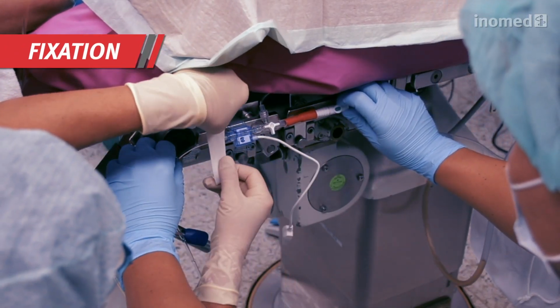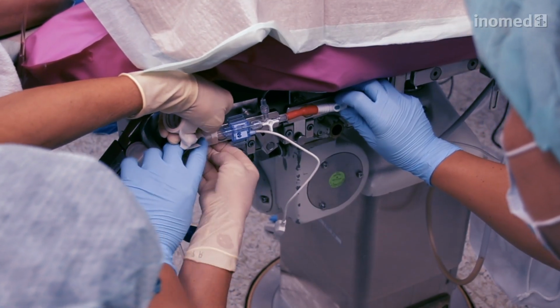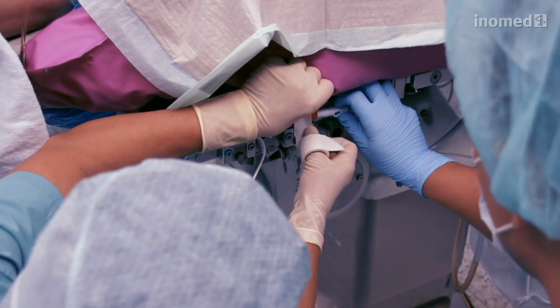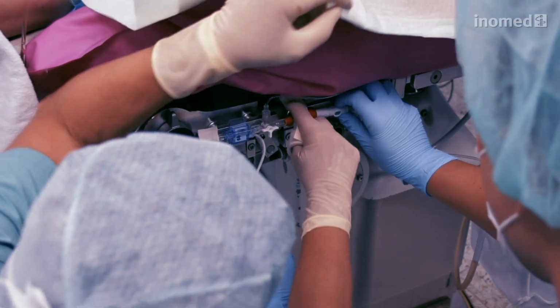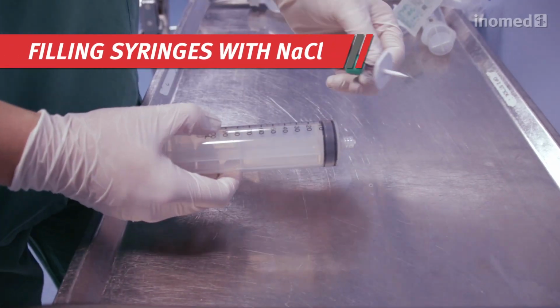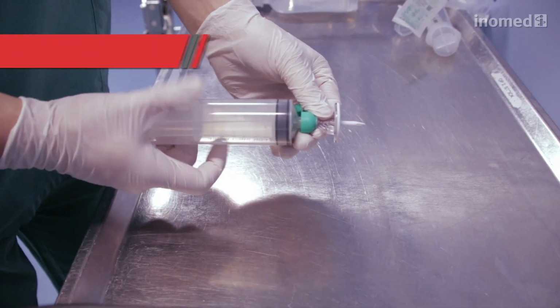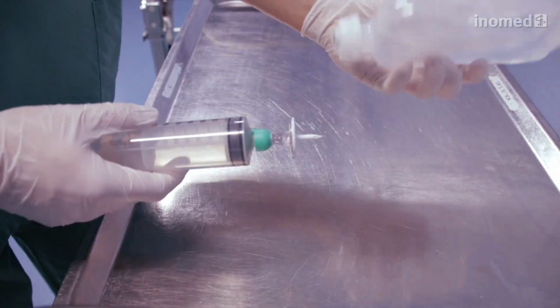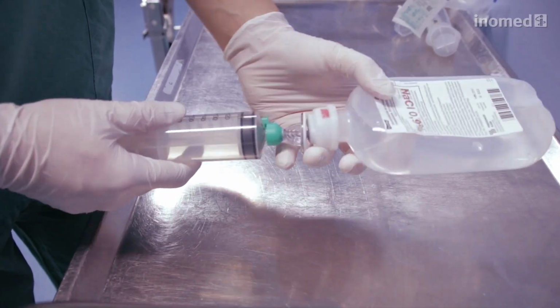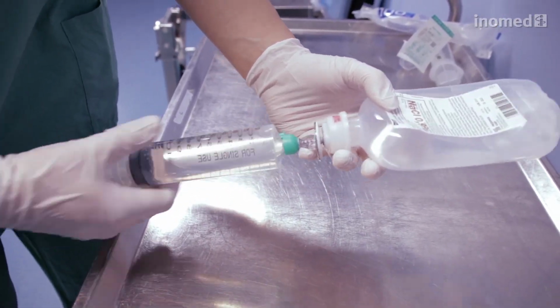The OR table rails offer an excellent mounting for the set to prevent the tubes from being squeezed or bruised. It is important that the three-way valve is accessible during the whole operation. Once the catheter set has been set up and fixed, the tubes have to be deaerated. For this, the provided syringes have to be filled with sodium chloride solution.